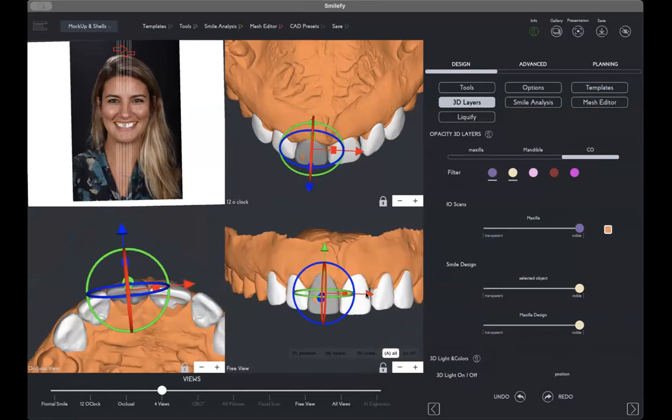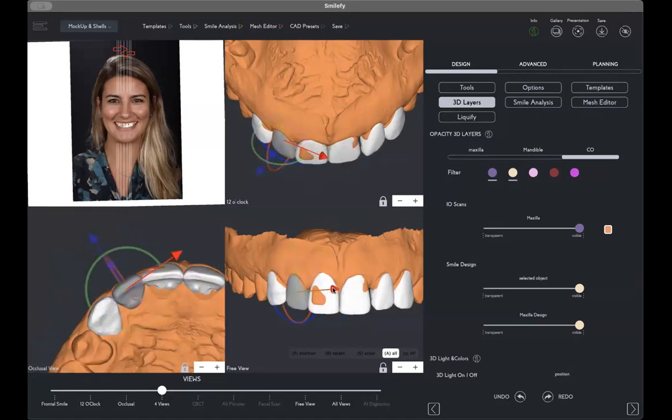Now, when we design in 3D, our design can be a motivational mock-up, additive. So everything covered by the new design needs to cover the patient's teeth. Or an ideal design, which can be subtractive and additive. What does subtractive mean?